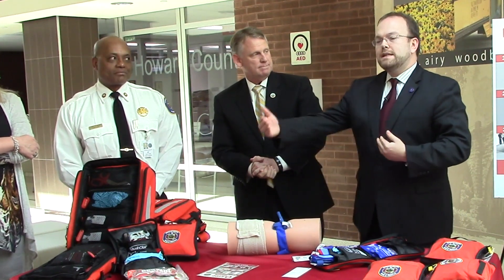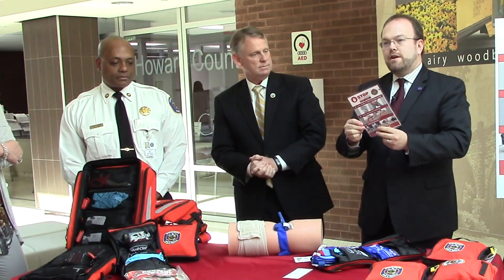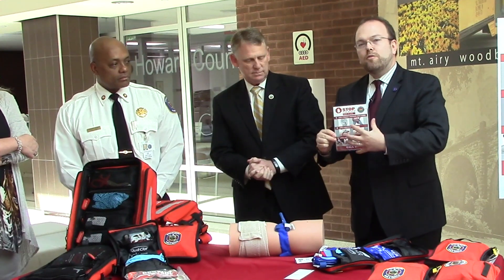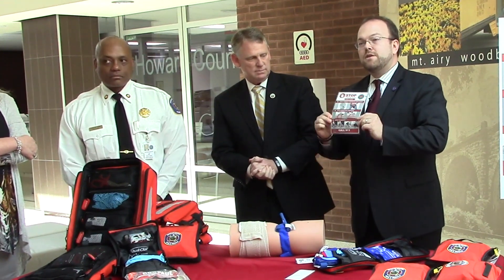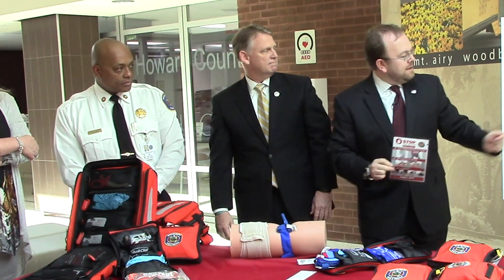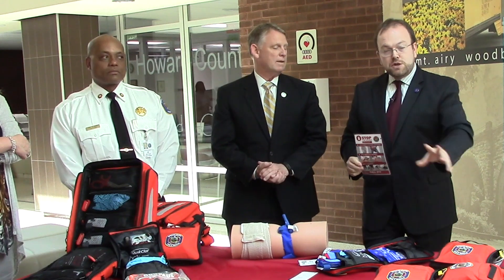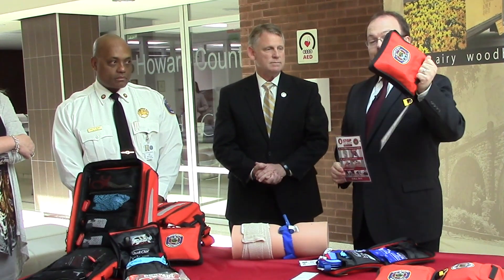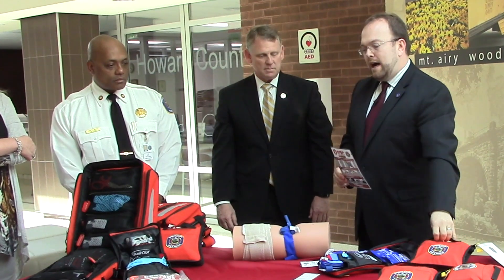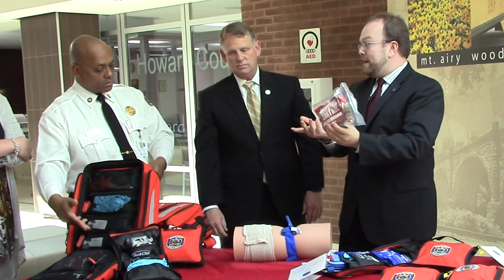That is our stepwise approach to how to control hemorrhage. As a reminder, we have the just-in-time instructions that myself and my colleagues at the Joint Committee to Enhance Survival have put together. These instructions are available both on our website and with every AED, and we have a larger poster of it here. That's how we control severe bleeding — these are what the kits look like; you'll see them around the county, pretty obviously marked. We also have a smaller version of the kit that may make its way out to more individual locations as well.